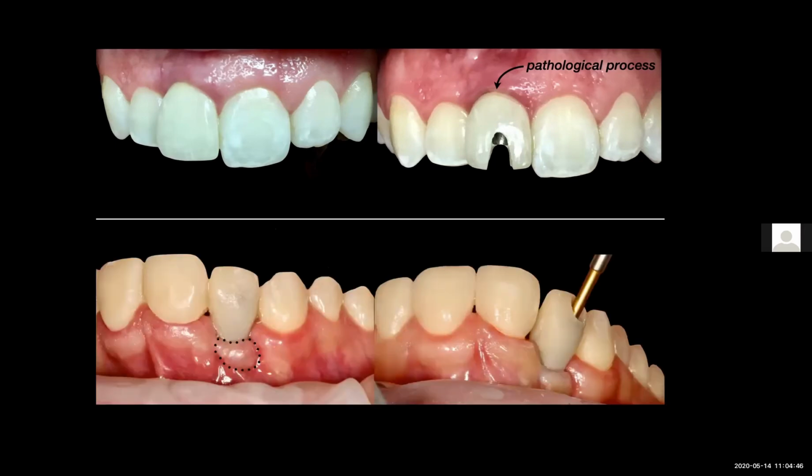The second example involved tooth number 7, and you can see it's a disastrous surgical result. The cause for this was damaging the buccal plate during the extraction, and the immediate implant was also angled too facial, which really exacerbates the loss of hard and soft tissue. Despite the heroic and very inspiring effort from the previous provider to perform a connective tissue graft to mitigate the loss of the buccal soft tissue, the level of recession is still very severe, as you can see, and is really aesthetically unacceptable to the patient. And without the supporting bone directly underneath the graft, the stability of the connective tissue graft is not very promising.